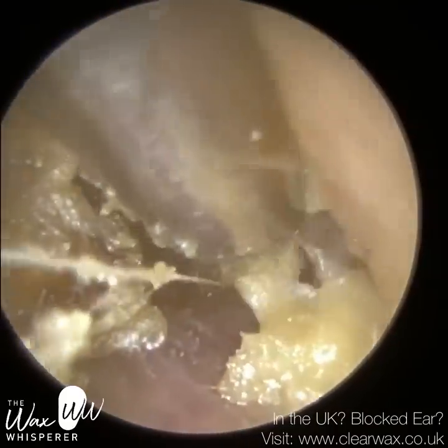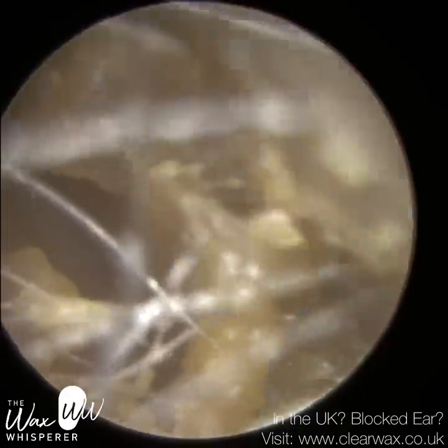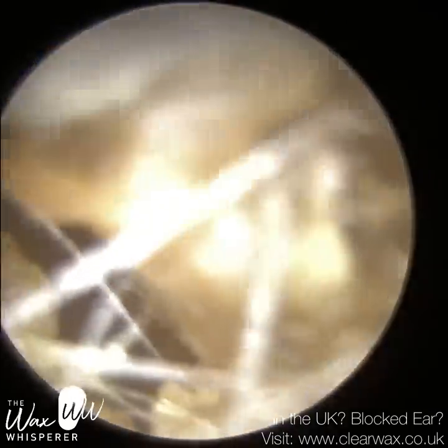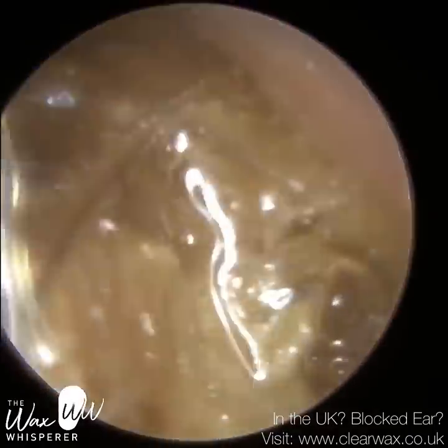So this is their right ear. They've got quite a narrow ear canal, and they've got this buildup of sticky, dead skin and wax. You can see it's got a kind of a caramel consistency. And I'm just using microsuction to vacuum this occlusion out of the ear.